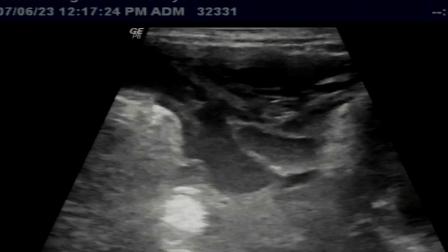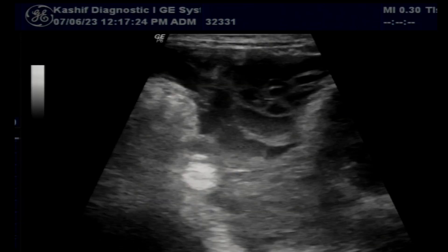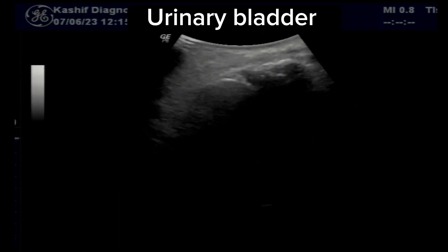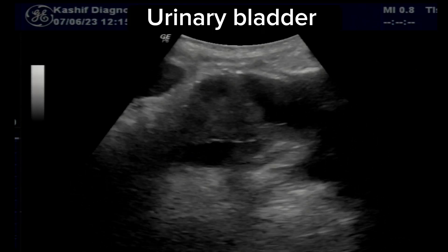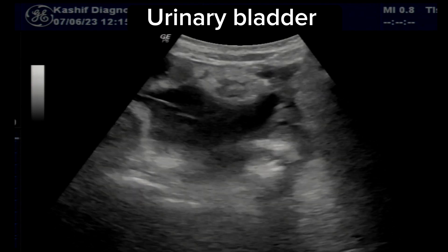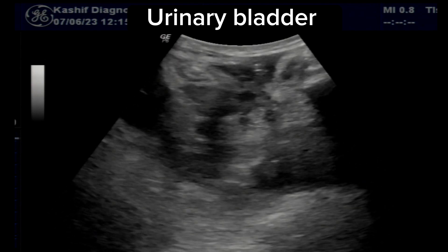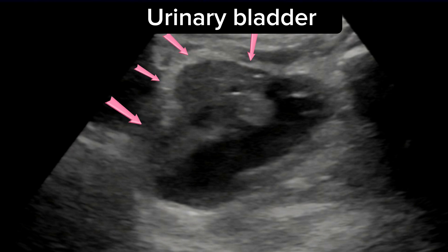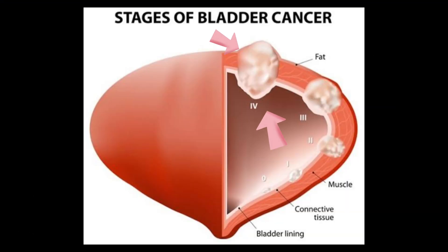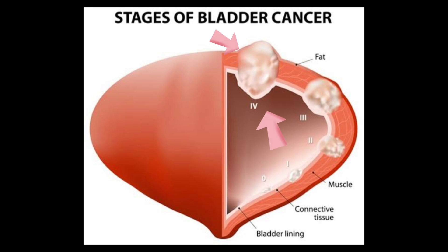When we focus on the urinary bladder, we see a large infiltrative type mass completely involving the anterior wall of the urinary bladder. There is macroscopic extravesical extension of the mass, and fixity with surrounding viscera is seen.